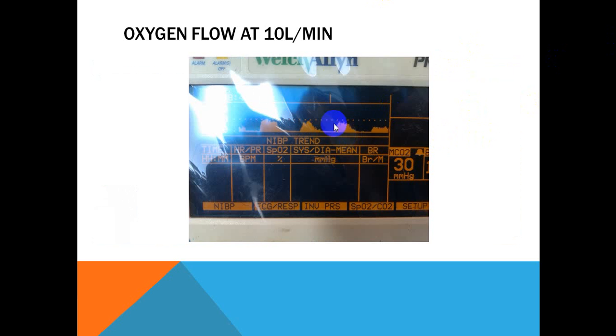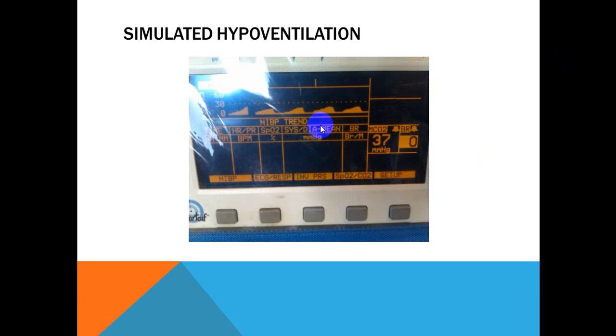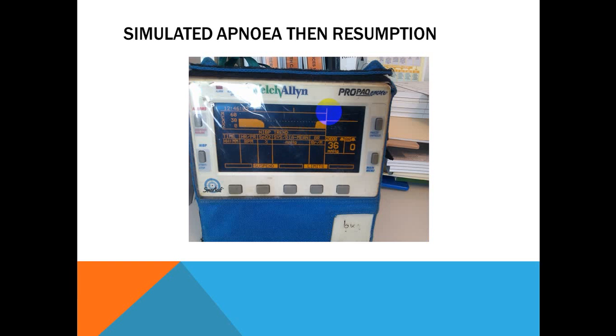And this is a further demonstration at 10 litres a minute. You see there's significant degradation of the waveform with some reduction in the measured end-tidal CO2 value. Here's simulated apnea by my colleague, showing obviously a loss of CO2 tracing. Here he simulated hypoventilation with low, shallow breaths, and that nicely illustrates a change in the waveform. This is to simulate a sedation effect having an effect on someone's ventilation. And then you see he simulated apnea with a resumption of breathing.